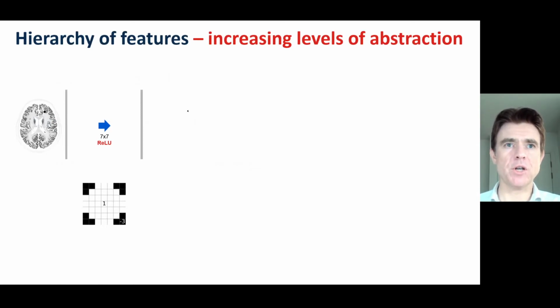I'm just going to give a basic introduction to this. Here again is a brain image with a lesion here, and as seen before, we can use some kind of pre-chosen kernel, though of course this will be learned according to the mapping in your training data that's required. You can see here that with this convolution kernel, we can see where that feature is, that lesion. So I've circled it here, and by using that kernel with a ReLU activation, we're ending up with just a feature map with that tumor or that lesion present.